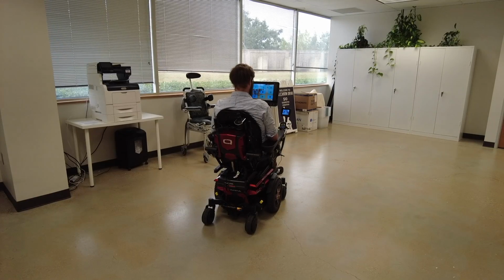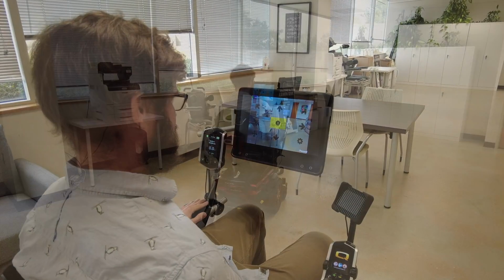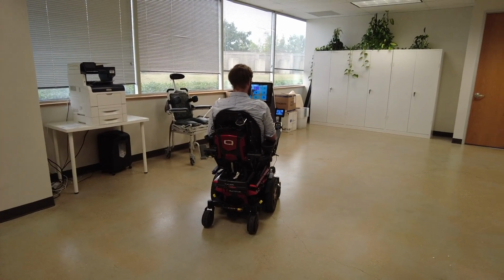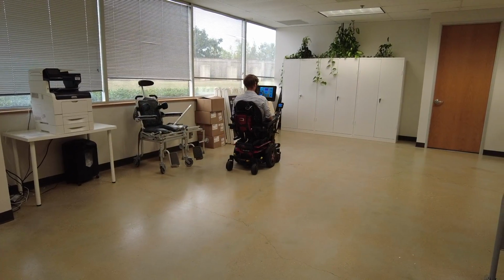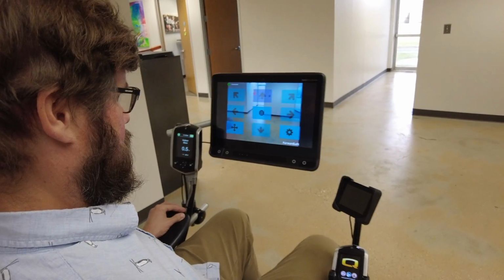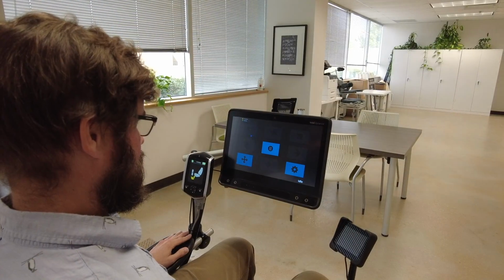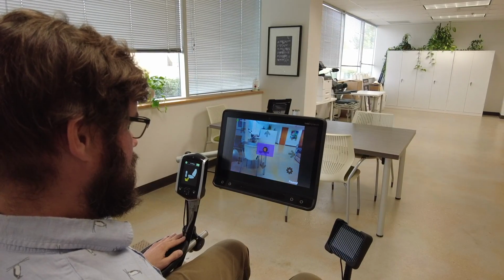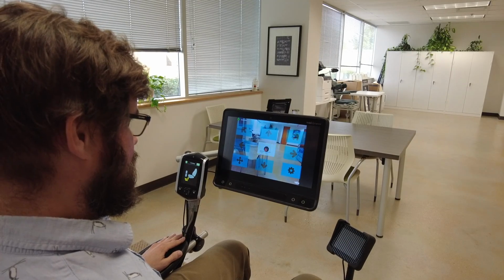If you look at the stop button for 4 seconds continuously, it will pause the Ability Drive software. To unpause the system, look at the stop button again for 4 seconds. Once familiar with the layout of the software and controls, the chair can be turned on. When turning on the chair, look at the stop button or ensure that no arrow button is being activated. Look at the appropriate arrow on the tablet to move the chair in each of the 6 directions.